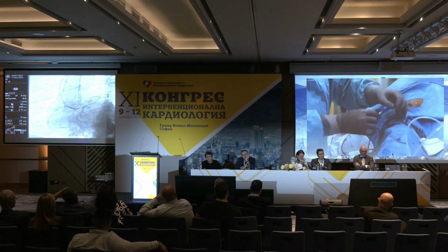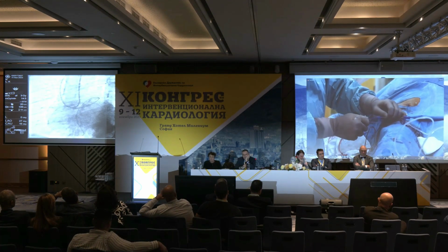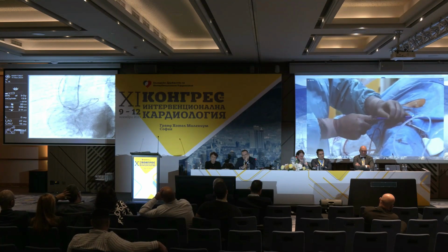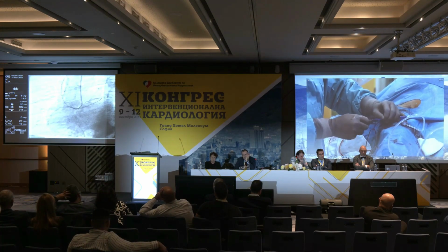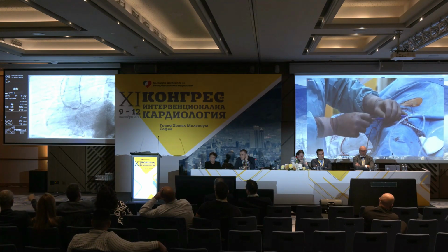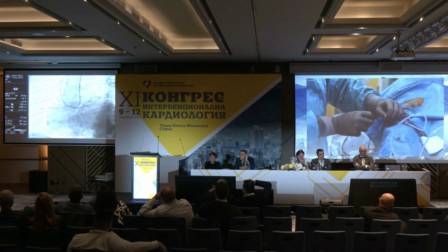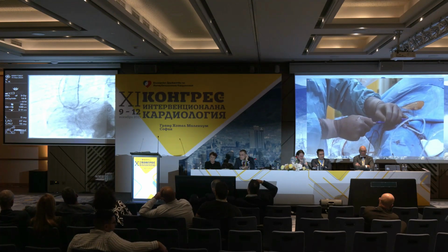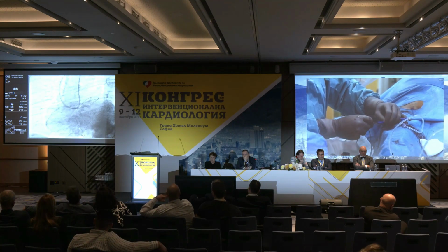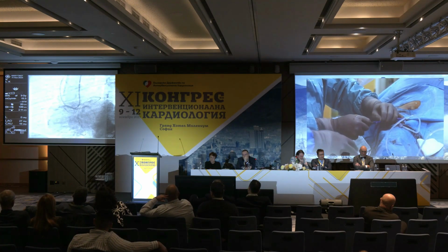And you see that I'm running there, because now, if I'm able to cross this proximal cap, then essentially the procedure is finished, but I'm pushing this microcatheter as much as I can, and it is stuck by this millimeter that it needs to jump in, and then we take a wire with a little bit more bend in order to enter the antegrade microcatheter. I don't know if I made any progress now. Contrast? Maybe I did, I don't know. Yeah, I did. I think I did.